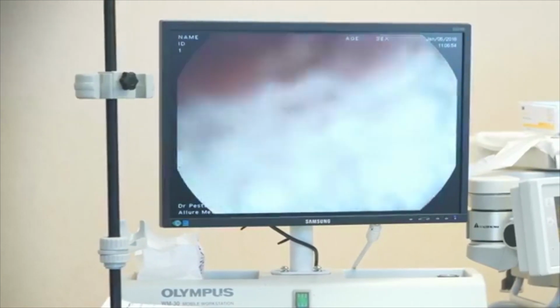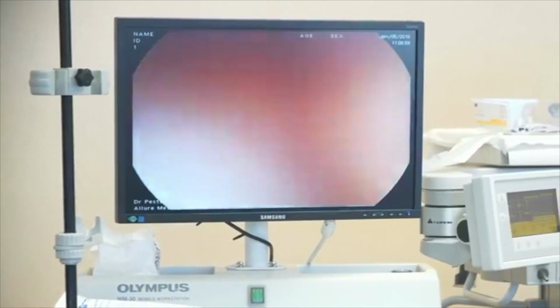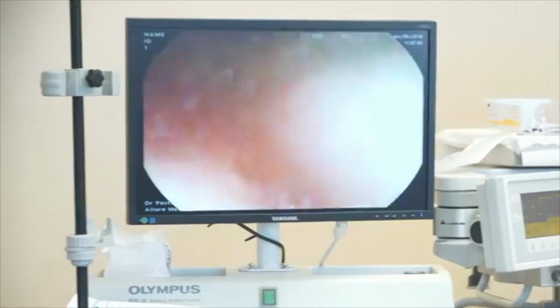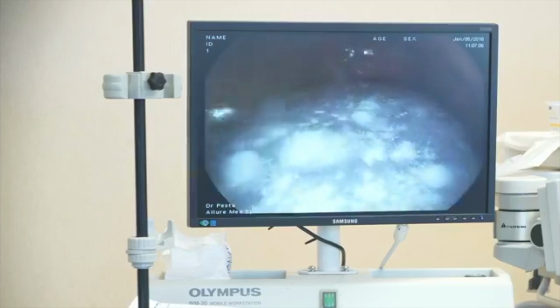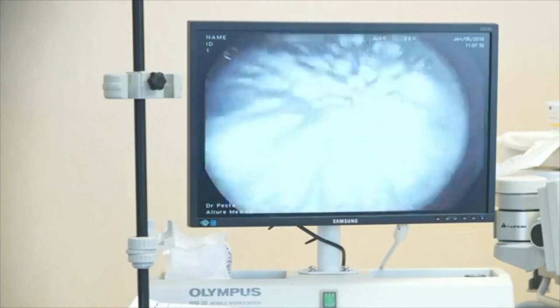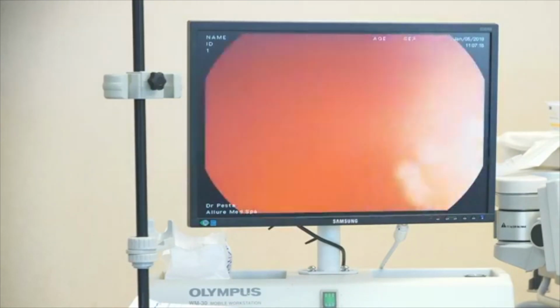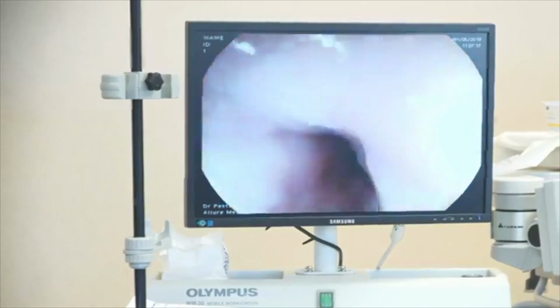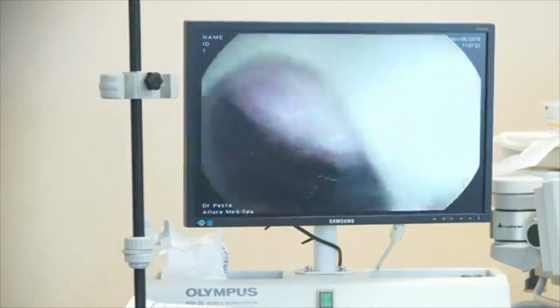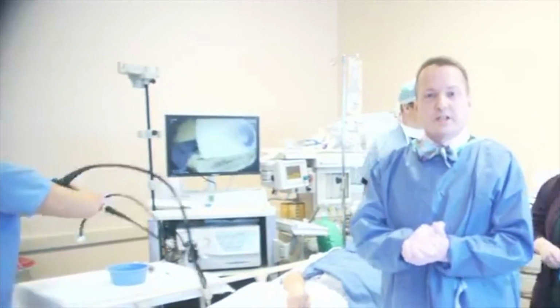We easily remove the catheter. You can take that for me. And here we have it now, the balloon in place. Just take a quick look inside the stomach. You see the balloon is comfortably resting within the stomach. Plenty of room to move around. You can even get beyond the balloon. But as you can imagine, it takes up space within the stomach. It's about the size of a grapefruit. So you get full much faster. And it keeps you satisfied for a lot longer. So essentially, that's the procedure.